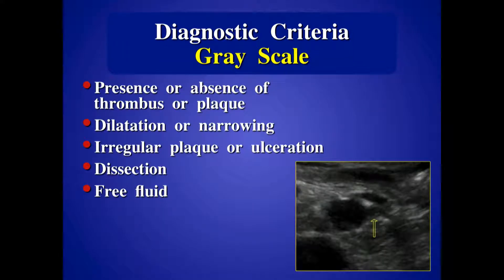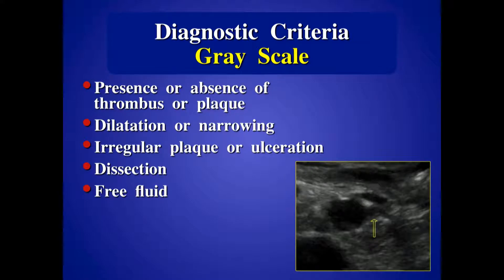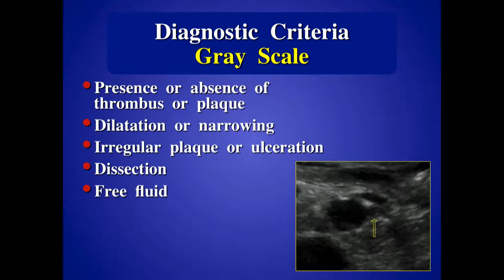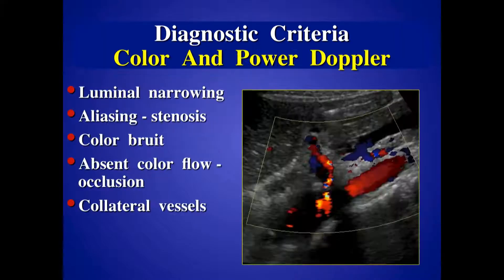Looking at the renal artery and seeing plaque — even a relatively hypoechoic plaque with good resolution, seeing the narrowing — even before you put the color on, allows you to determine there's going to be something there. Also look for evidence of dissection, look for a flap, look for fluid around the aorta, look for an aneurysm — all important parts of the exam.